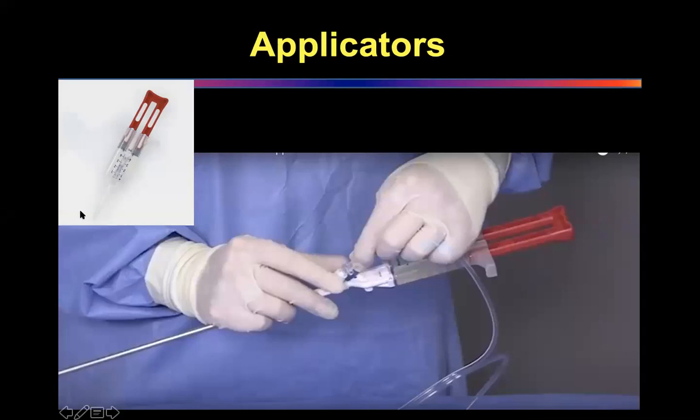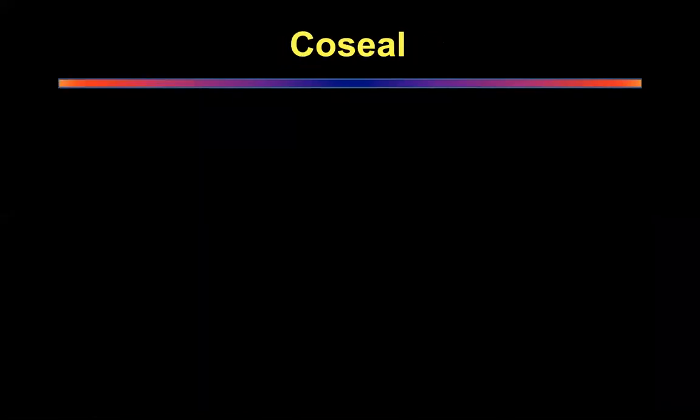This is available either as this tip, which is just a direct application tip, or you have this minimally invasive long tip. And this is the one that I use. I prefer the minimally invasive long tip. It always has 2 solutions within it. And then this pressure device gets attached with a Luer lock to the tip. And as you inject, that pressure disperses the sealant over a large area.